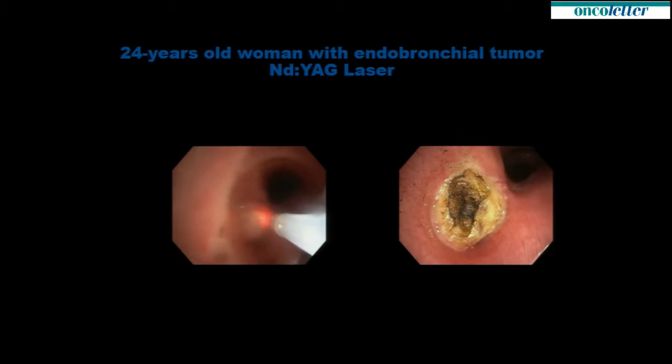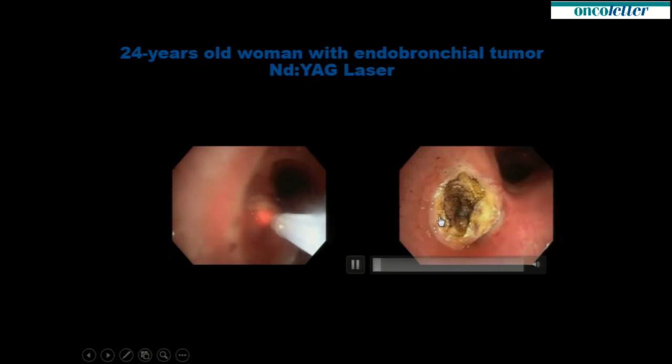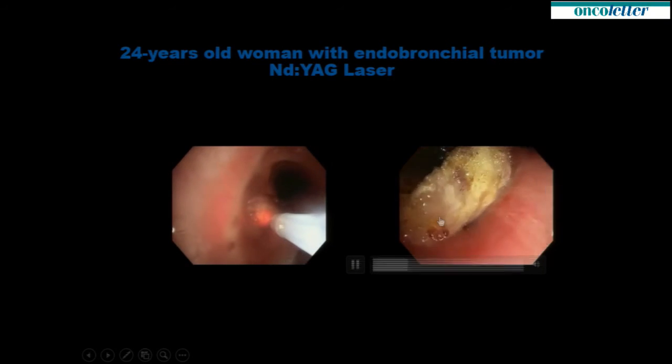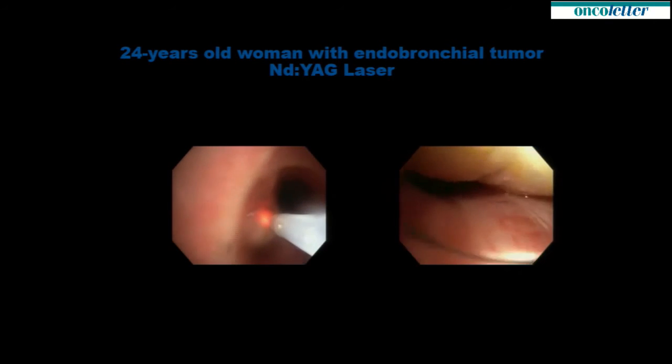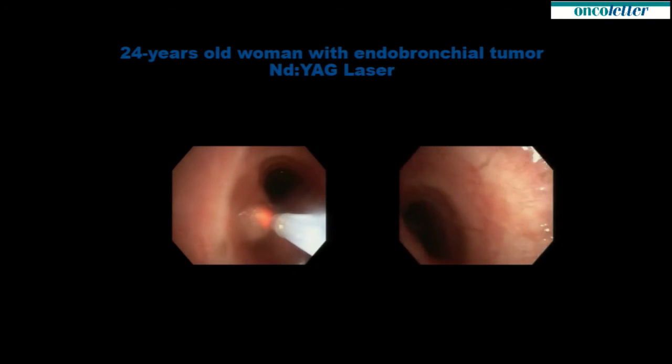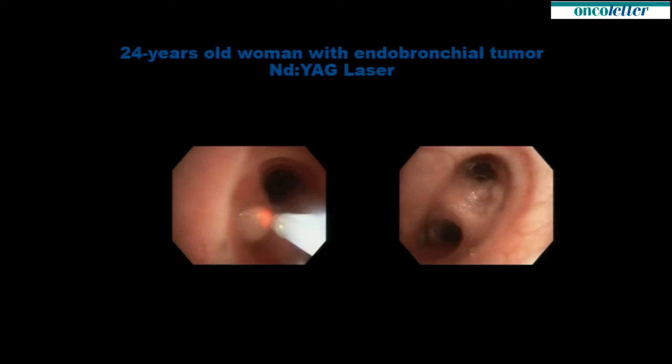We began with a laser, so you can look for minutes here, because it's a very low energy laser, just 10 watts, but what you see is that the tumor is going pale and pale and pale. That means it's devitalized. Thereafter, the tumor looks like this here, and then you can make a passage into the depth of the bronchi, and you see here there is a normal bronchial mucosa.